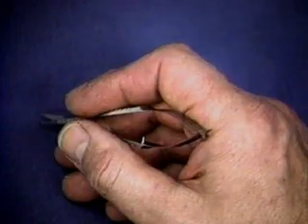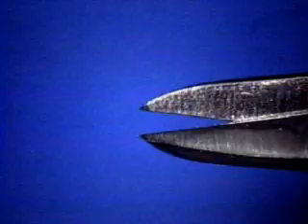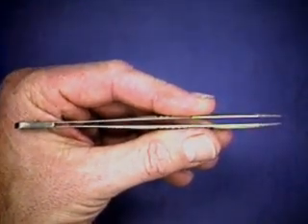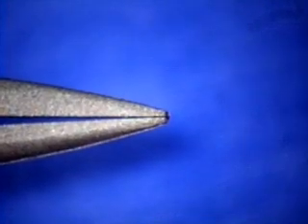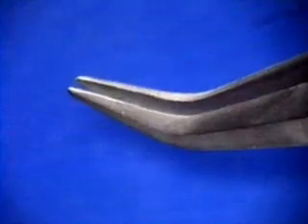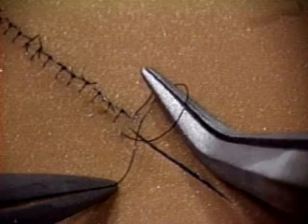Let's take a look at tools and materials. Here are the instruments you'll need. A pair of scissors with fine pointed tips for cutting the suture, a straight jeweler's forceps for your left hand with tips that meet nicely like this, and an angulated jeweler's forceps for your right hand. The angulated jeweler's is both a needle holder and a tying forceps.